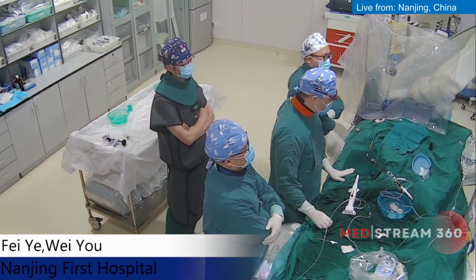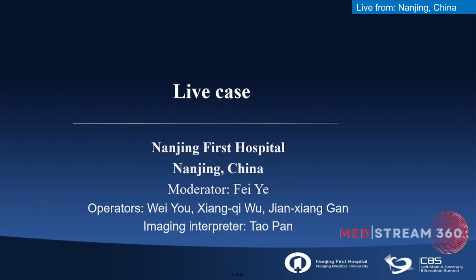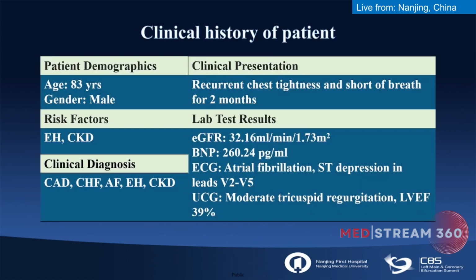Morning. It's our great honor to show you this case. I'd like to invite Dr. Xiangqi to give you a case introduction for this patient. Doctor, please. Good morning, honorable experts. It's my pleasure to show the patient's information.